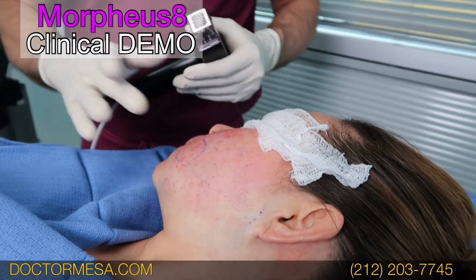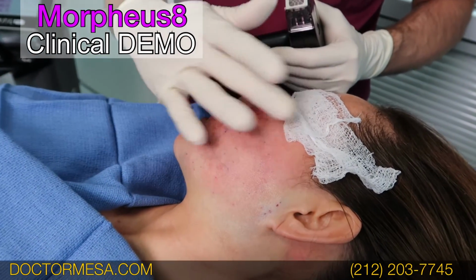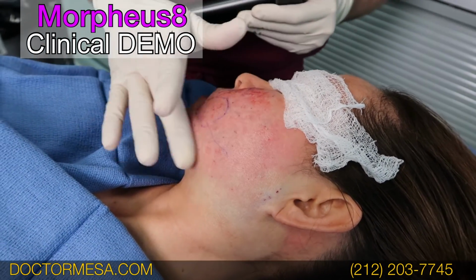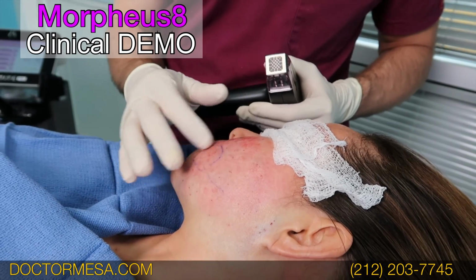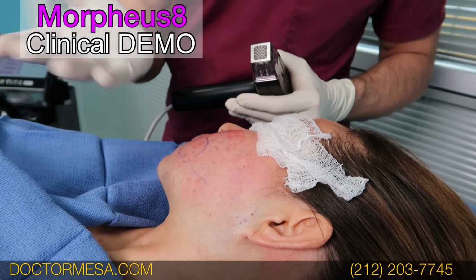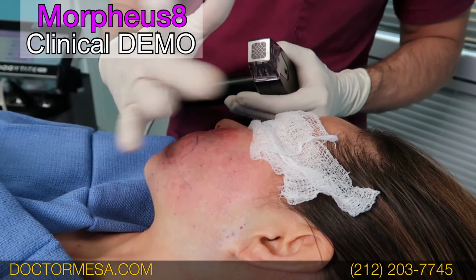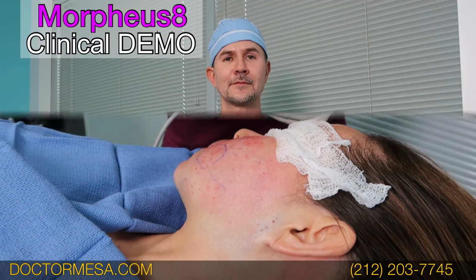Okay, so we are all done. Now, once the numbing medication disappears, she's going to have less swelling, and then she's going to have some little teeny tiny dots in the skin. As I mentioned before, they're going to last for 1 or 2 days, and then after 2 days she can put makeup on and go back to work. If they are guys, usually the dots disappear by that time, so you can go back to work.